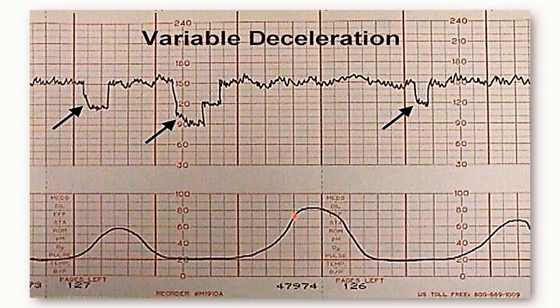Long after that, another uterine contraction can be seen, but the deceleration is happening long after the occurrence of the uterine contraction. So basically there is no pattern between the occurrence of the uterine contraction and the fetal deceleration, and the appearance of variable deceleration is also considered to be abnormal in the CTG graph and needs to be critically reviewed. Same like prolonged acceleration, there can be prolonged deceleration.